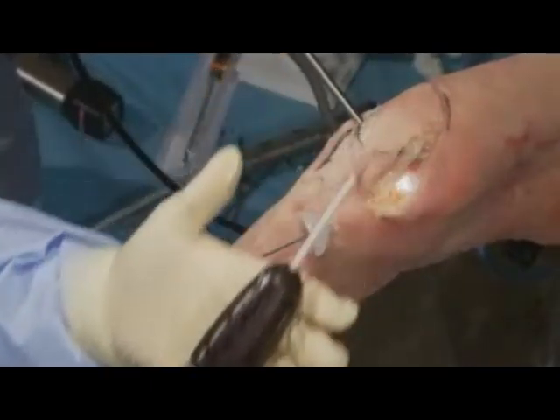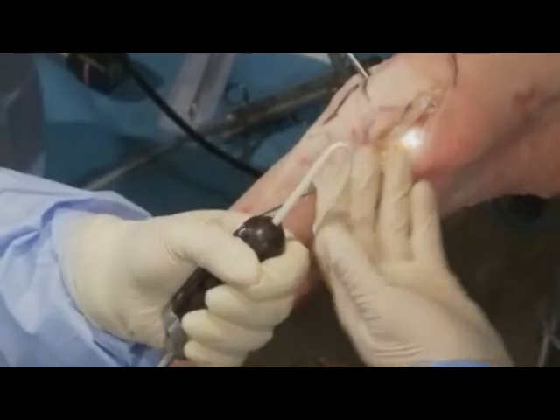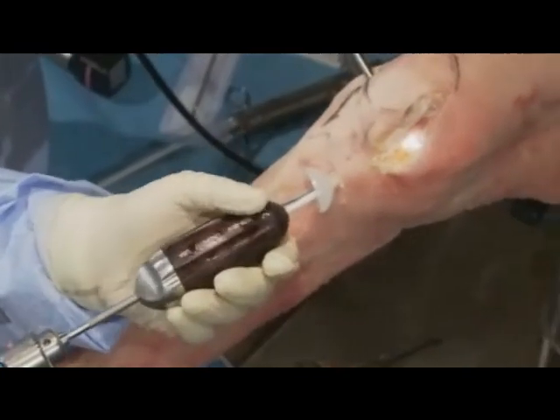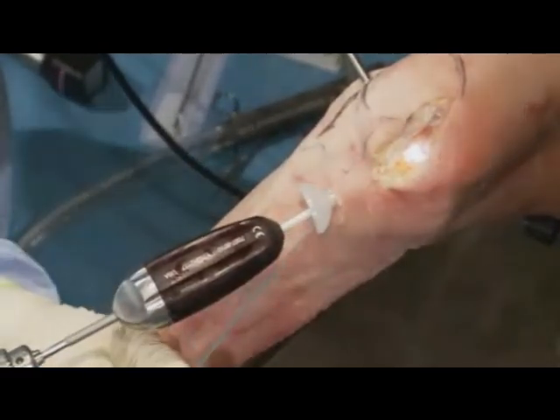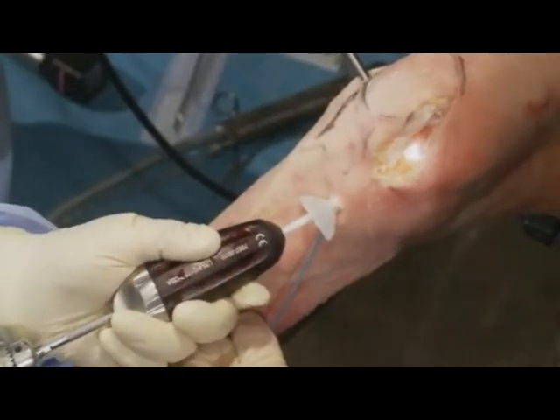Actually, we could probably cement now. As you see, we have this. It's on power. Cement is in here, and by power, we can extrude the cement under significant pressure. So by putting it up through this area here, holding this device, and putting the cement up in, and somebody pulling on the suture, can you just grab the suture? What we do is we have a pressurized system into the joint now.